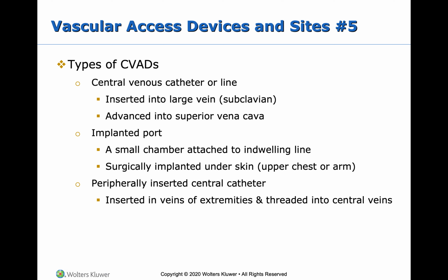None of these are so as a phlebotomist, you will not be able to access any of these devices. You will have to get a nurse to access them for you, and they may require you to try to poke the patient at least once and get blood elsewhere before they access one of these. And that's because if they are running IV fluids through one of these already, they're going to have to stop running the fluids, wait 5 minutes, flush the line, pull the blood, discard the blood, flush the line again, then start the IV fluids again.